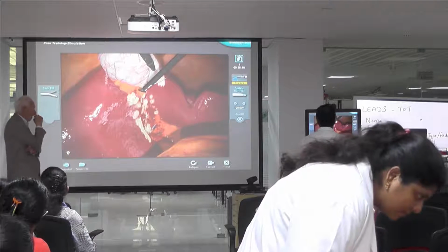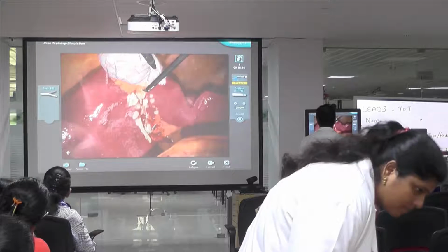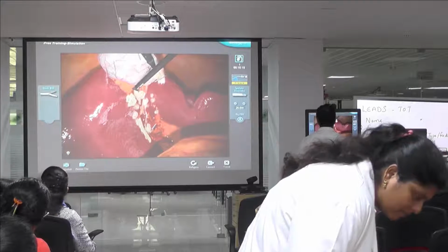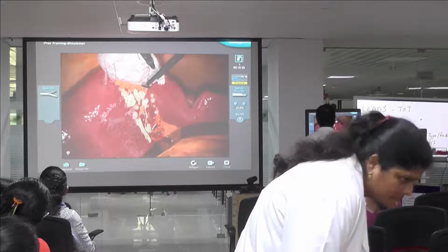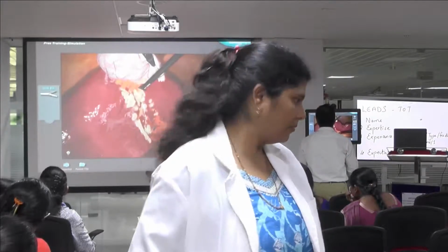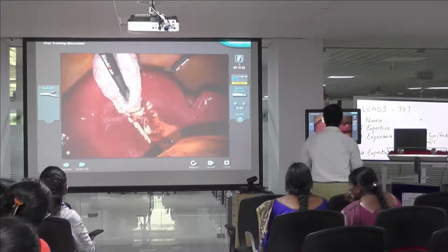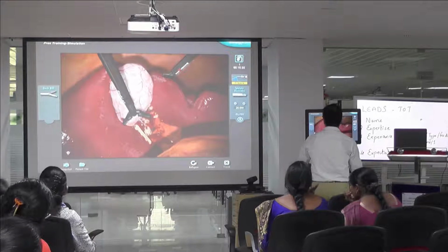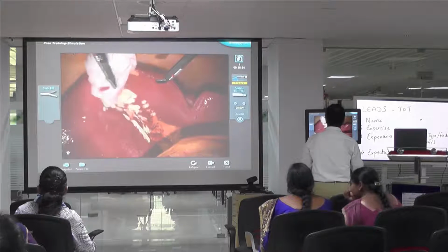So we have now the fourth component task, which is mobilizing the gallbladder off the gallbladder bed. If you use this systematic approach for whatever procedure in your profession, then you can again find this kind of elements, this kind of steps, in any procedure.